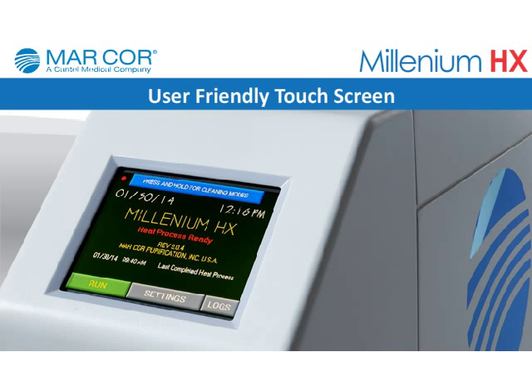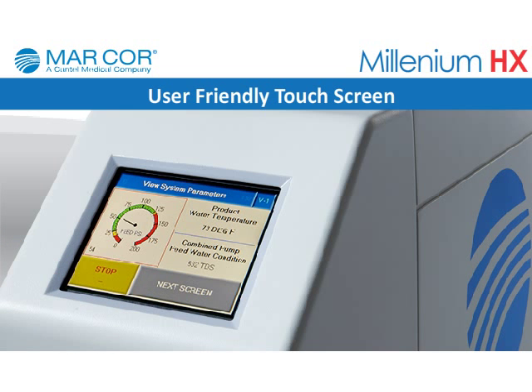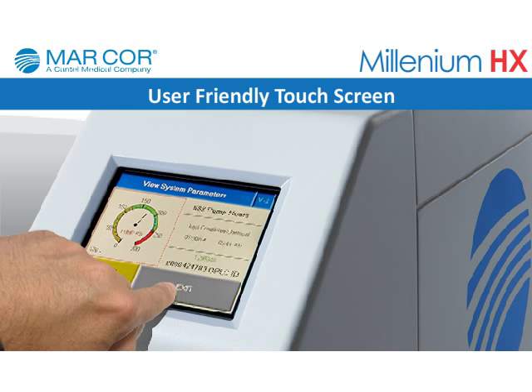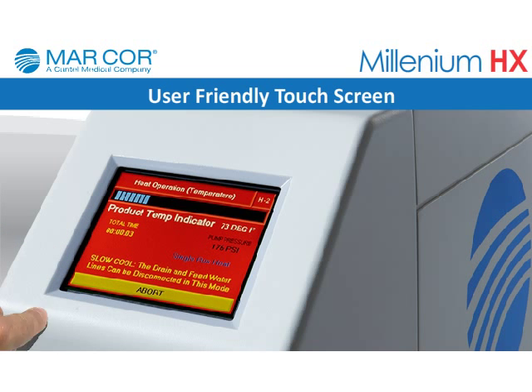User-friendly touchscreen: The unit features a full-color touchscreen using an LCD control panel that offers a clear display of operational functions and key parameters all in one location, giving the operator a view of all production results, including detailed written system navigation tools.